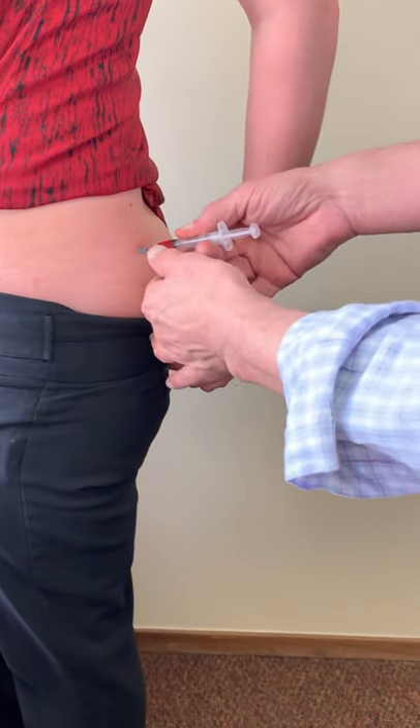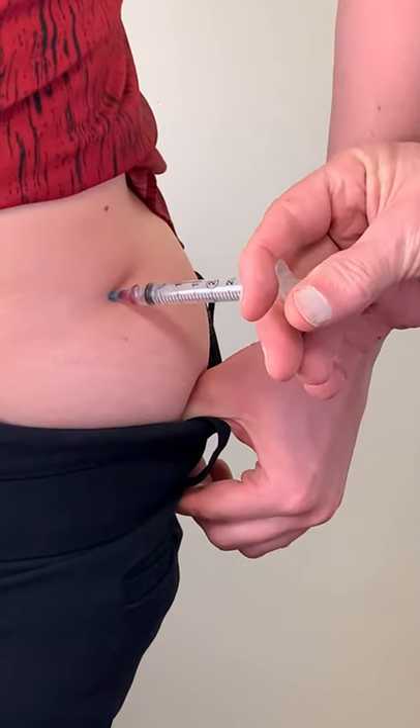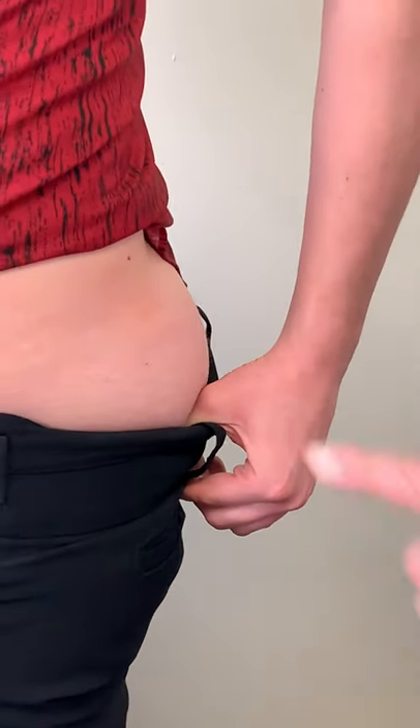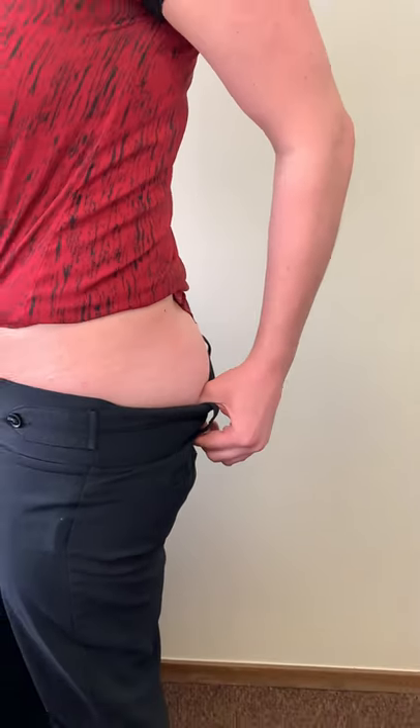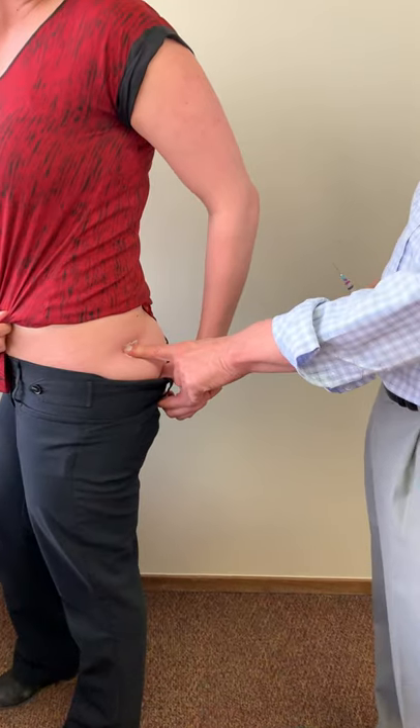We take our medicine and very quickly poke the needle in — you won't feel a thing, boom, just like that. Then we squirt it in, and as soon as it's done, pull out real fast. If by any chance there's a little bit of blood, we take our alcohol and hold pressure for about 30 seconds, and then we're done.